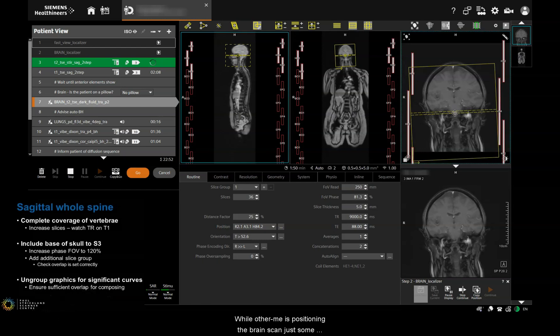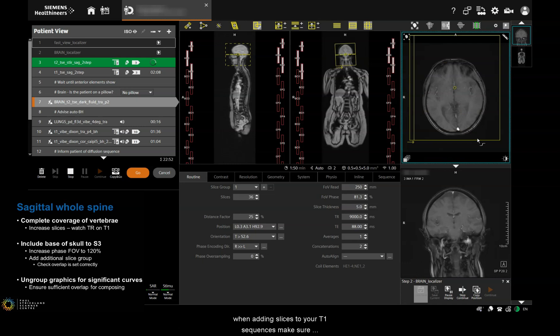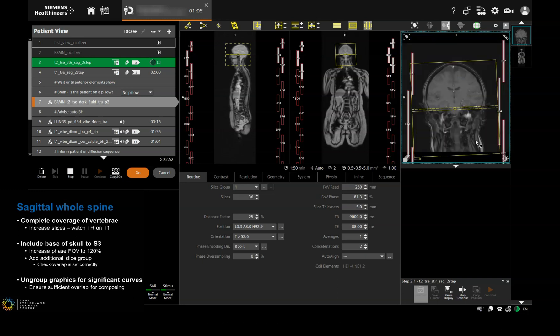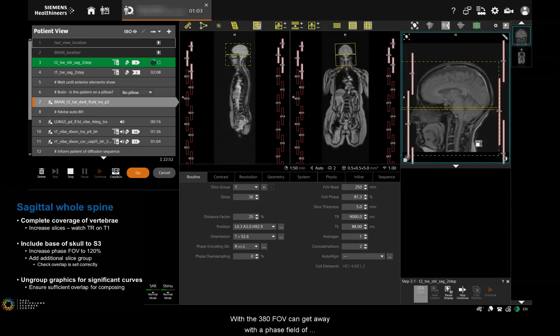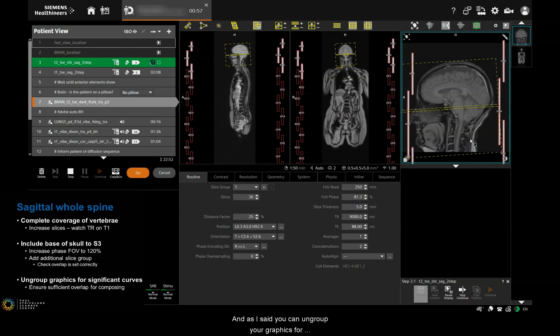Some notes on the sagittal whole spine sequences: when adding slices to your T1 sequences, make sure your TR doesn't go too high, and if that happens you can add a concatenation and reduce the TR again. With the 380 FOV, you can get away with a phase field of view of 120% on a sagittal, or you could add another slice group — just make sure your overlap is set correctly. You can also ungroup your graphics for significant curves.